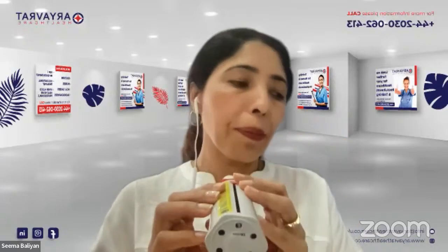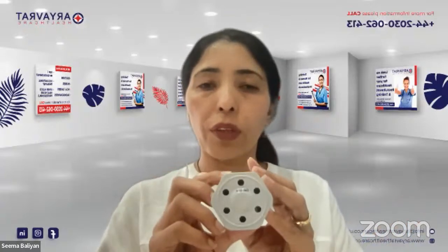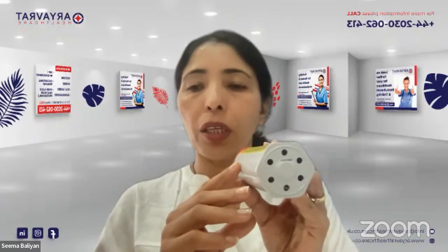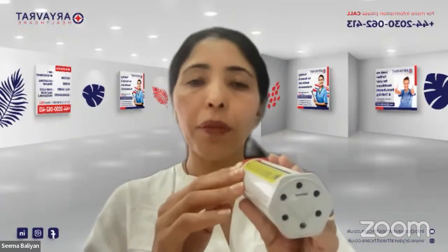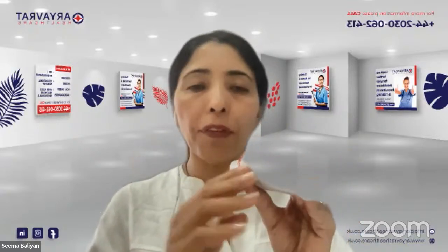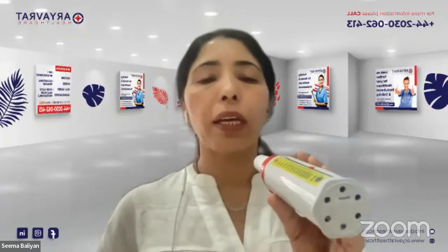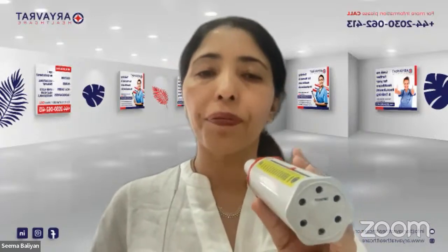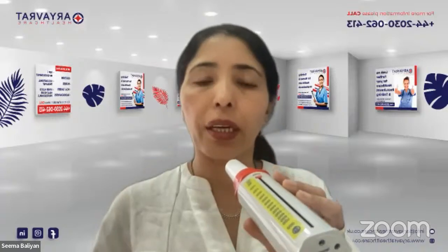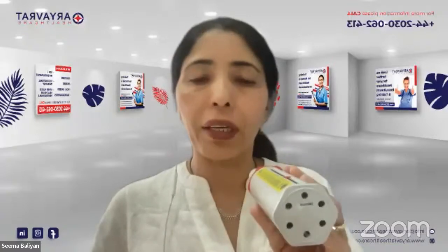So say, for example, our first reading is 380. So we have noted down the first reading. We are then going to do the second huff in the same manner as we did the first one, taking a deep breath in, making a tight seal around the mouthpiece, and then giving a sharp huff, and noting down the second reading. So the second reading, I would say, is 400. Then I bring the plunger back to 0 and I do the third reading. The third reading comes as 370.